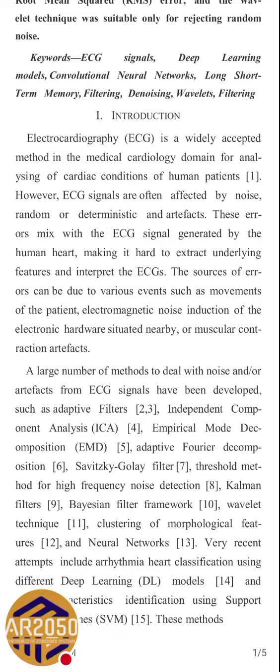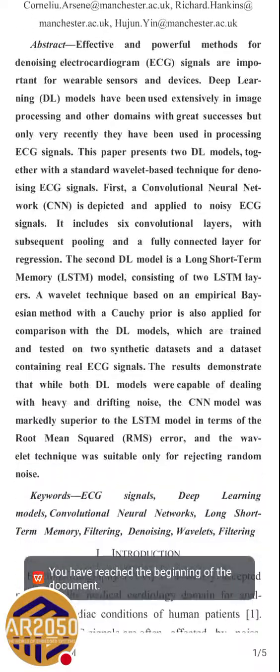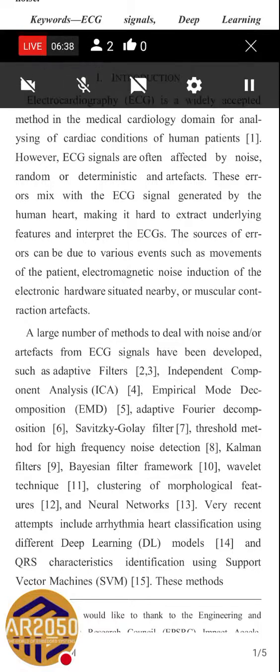So if we study implementing a learning model, we could implement it in any kind of model, just like DeepFilterNet used for speech enhancement. Speech is also a real-time signal which could be used for a deep learning model.